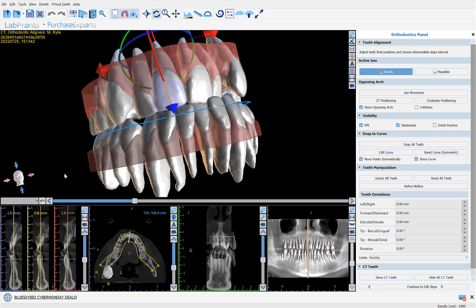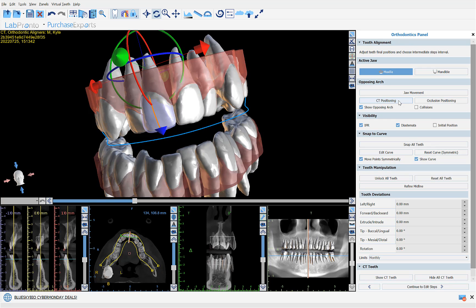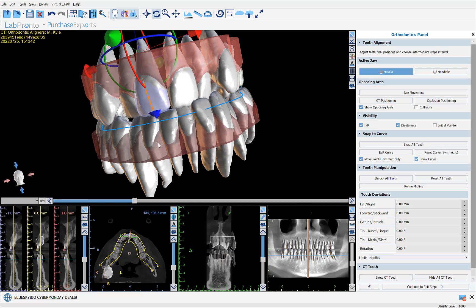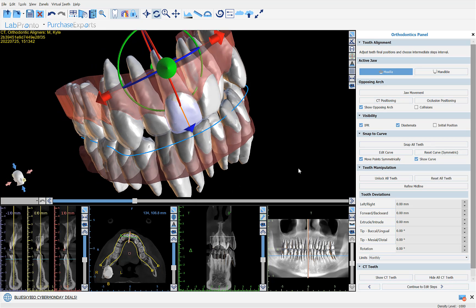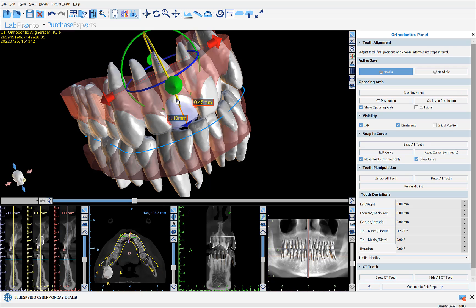What we see on screen now are our models with our automatically segmented CT teeth automatically aligned to the models. We have two options for mandibular positioning: occlusion positioning and CT positioning. If we click on CT positioning, the jaw opens to the position of the mandible in the CT scan. We can return to occlusion positioning by clicking the occlusion positioning button. Whenever we move any tooth, both the segmented crown from the STL model and the full tooth with its roots from the segmented CT scan move together.